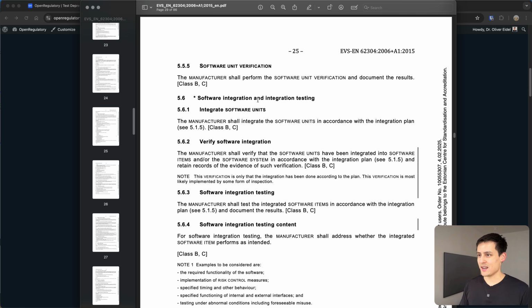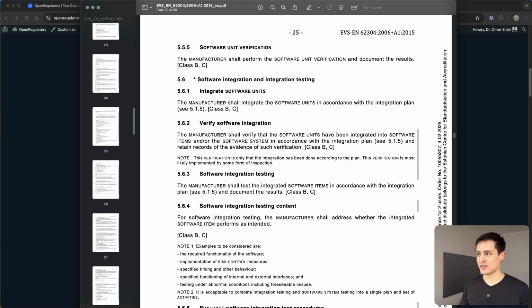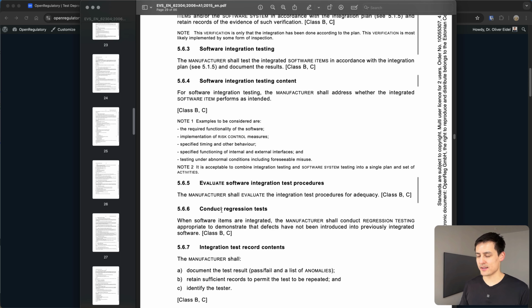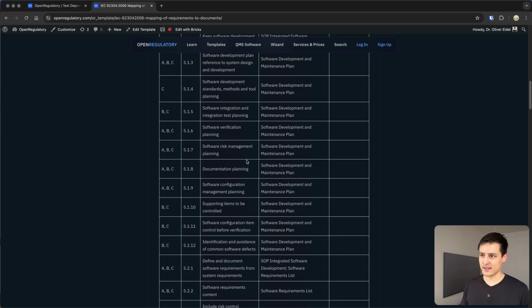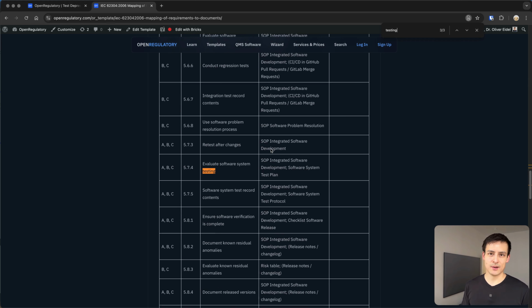This is a very ancient concept, and nowadays integration testing is, I guess, interpreted a bit differently. Anyway, you should do this and we'll look at how to implement that. And also do something like regression testing, all that stuff. All right, so I'll stop there and just show you the quick overview, where again there's the mapping table where you see different testing requirements, but that's pretty much just what I told you earlier. Let's actually dive into how typical compliant documentation for testing looks, and then reverse engineer how a good automated procedure for this would look.